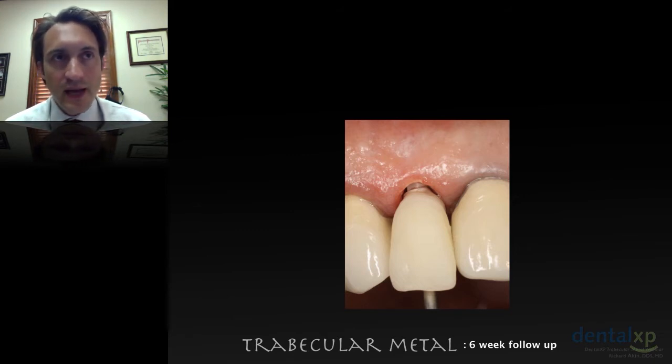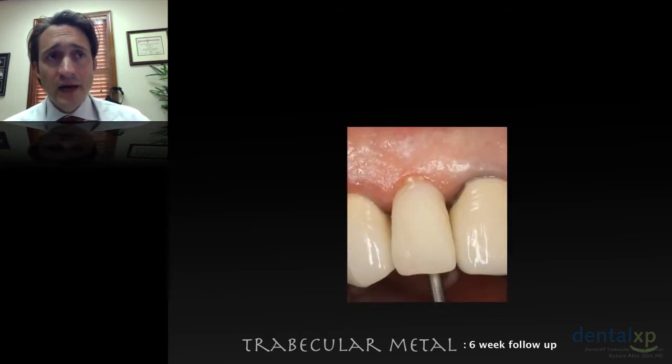Dr. Sonia Lizet in Vancouver, when I had spent some time with her, she was using this, and she had this formulated from a local compounding pharmacy, and I've done the same, and I really like it in these areas. Sometimes when we have any kind of provisional, components may not have the best seal, so this is a nice way to seal, to kind of add an antimicrobial agent to the sulcus. And here it is seated finally, and this patient is ready for final crown delivery and impressions and delivery, and he's thrilled.